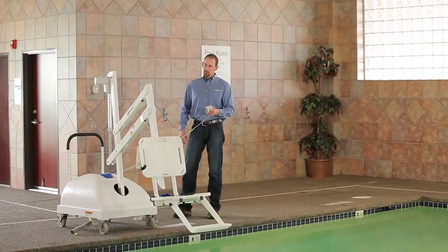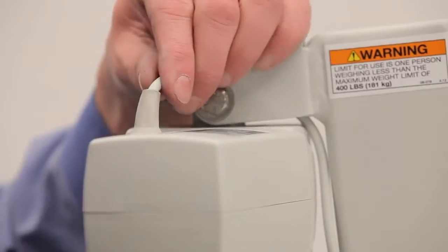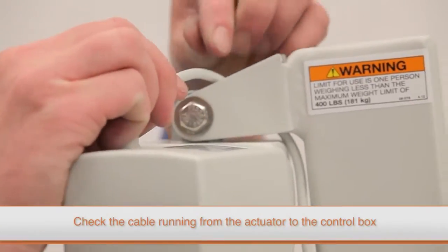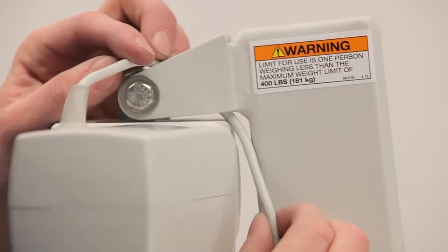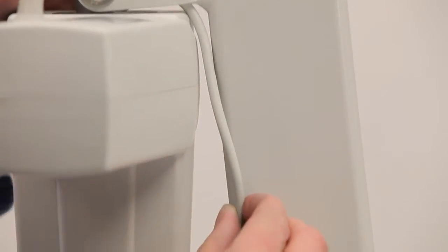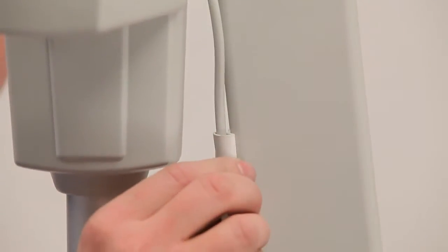If your lift does not move up or down, you may have a problem with either the actuator, the control box, or the cable that connects them. First, check the cable that runs from the actuator to the control box. If it is pinched or damaged in any way, you will need to replace the actuator and the control box. If the cable appears to be in good condition, you can move on to testing the control box.